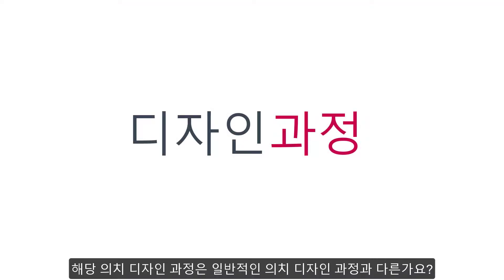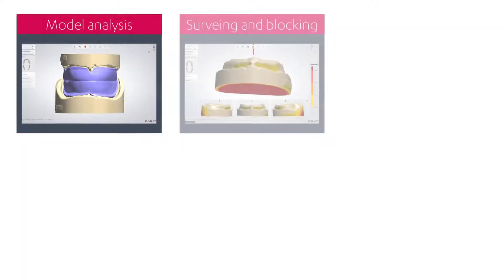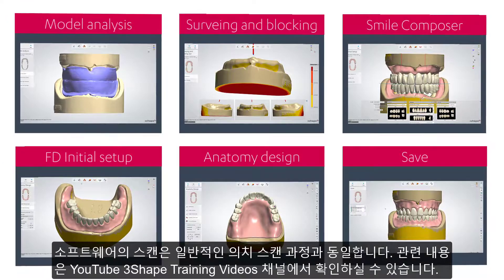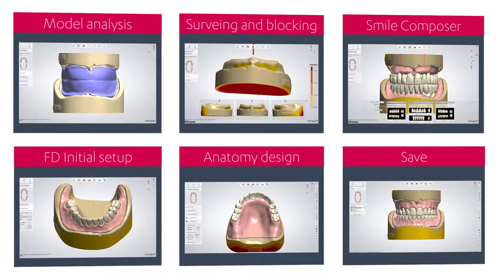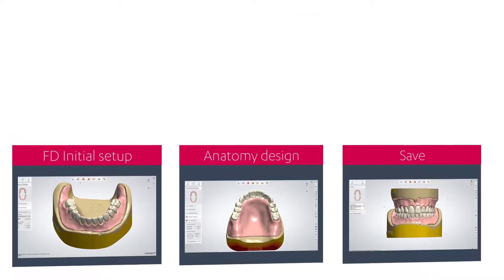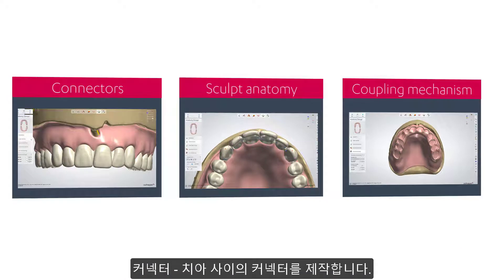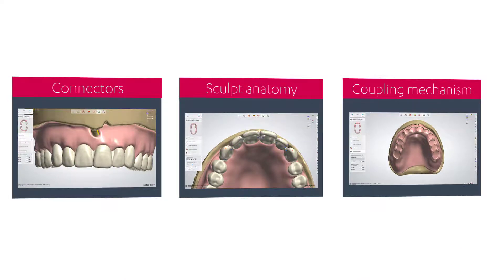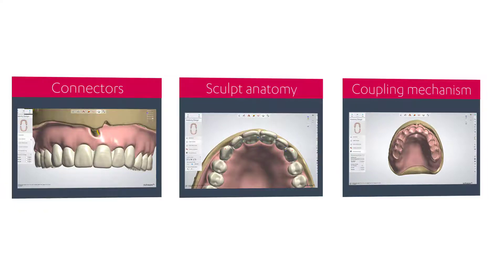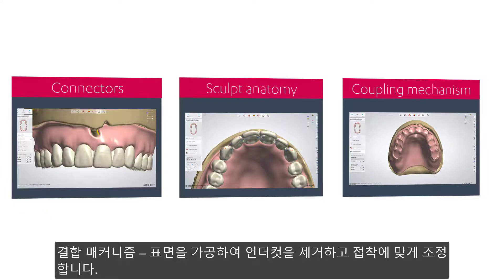Does the design process for this type of denture differ from the standard denture? The scanning in the software is the same as for the standard denture shown in our previous videos. However, during design, you'll have three additional steps: Connectors, to create connectors between teeth; Sculpt Anatomy, which will allow you to adjust the shape of the teeth; and Coupling Mechanism, which will create an artificial surface to remove undercuts and adapt it for gluing.